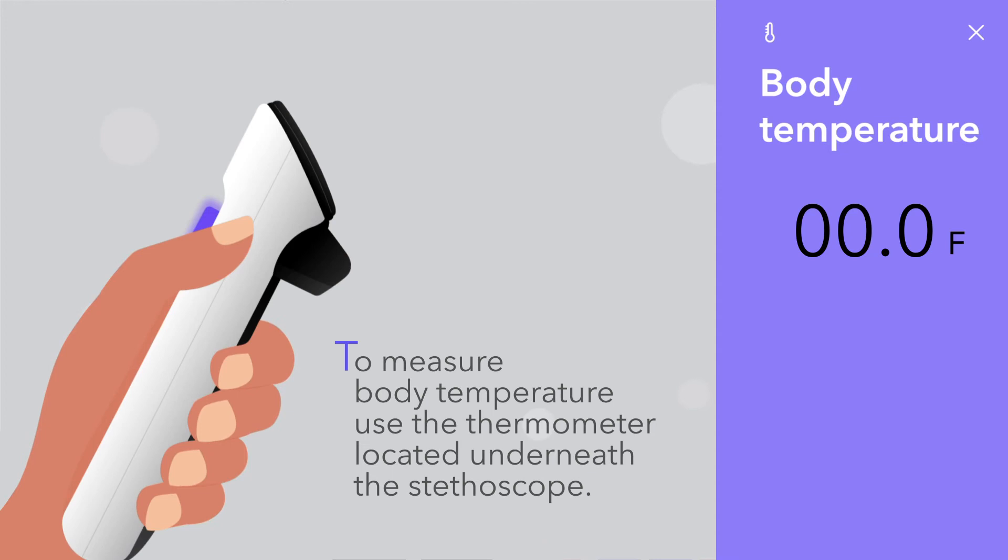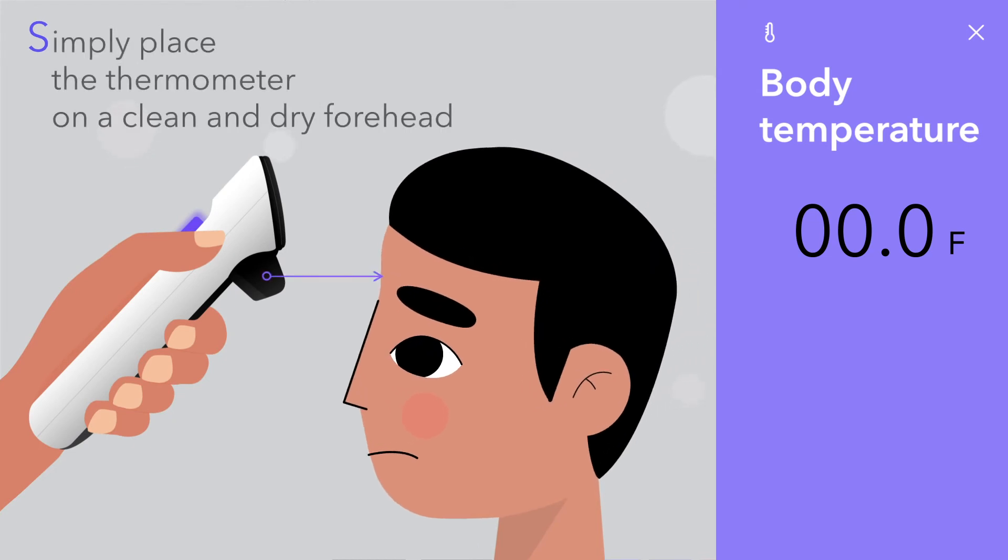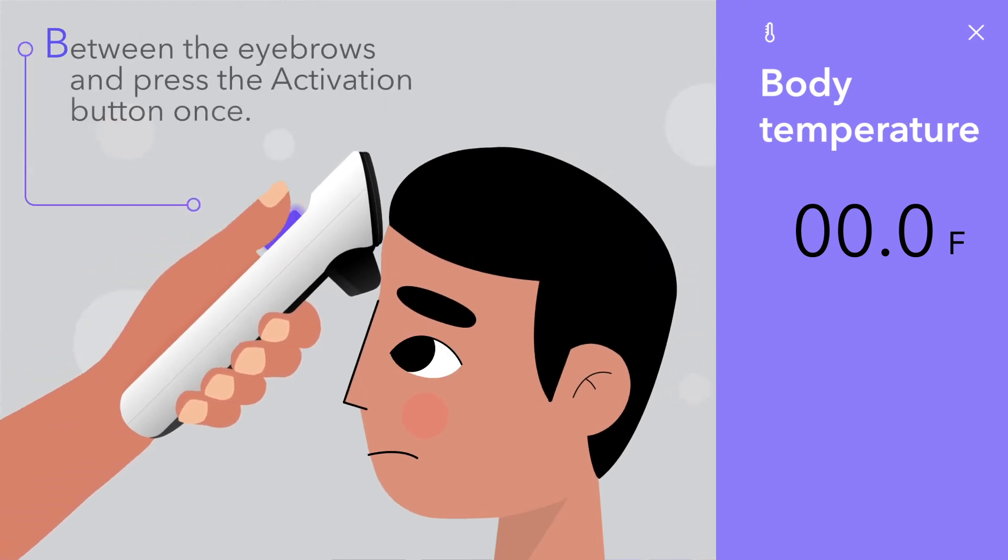To measure body temperature, use the thermometer located underneath the stethoscope. Simply place the thermometer on a clean and dry forehead between the eyebrows and press the activation button once.